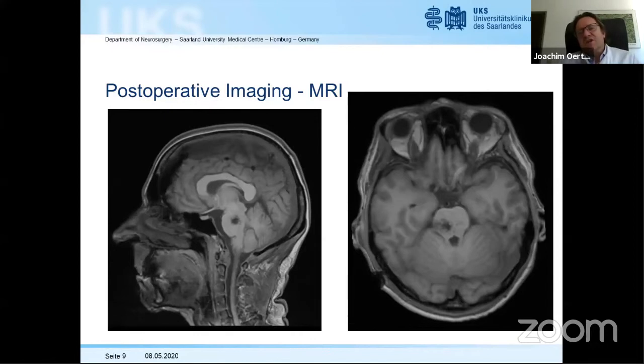We basically always do endoscopic-assisted in all other lesions. Some very small acoustics we have done with pure endoscopy, but as soon as you need a lot of manipulation and you're not sure what to expect, then we do microscopic with endoscopic assistance. Okay, thank you.